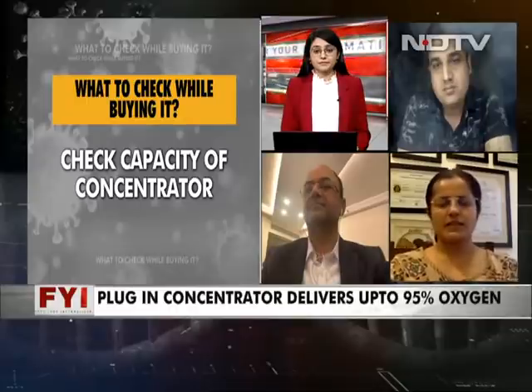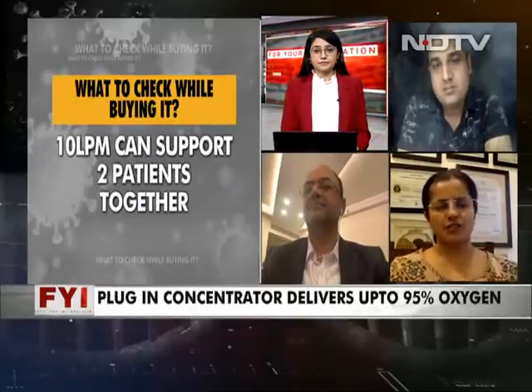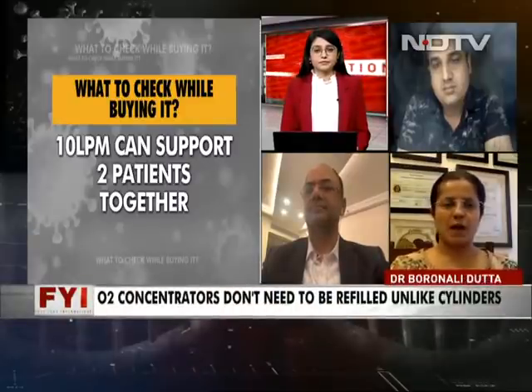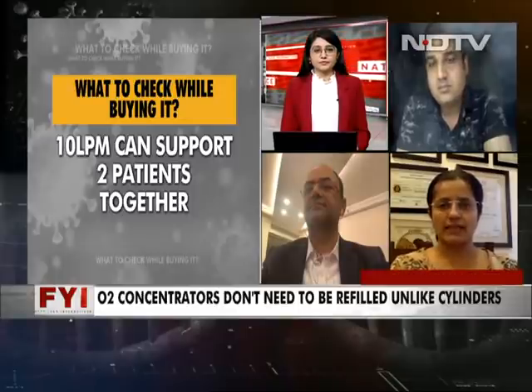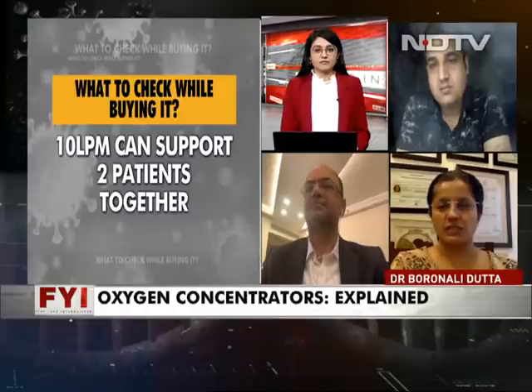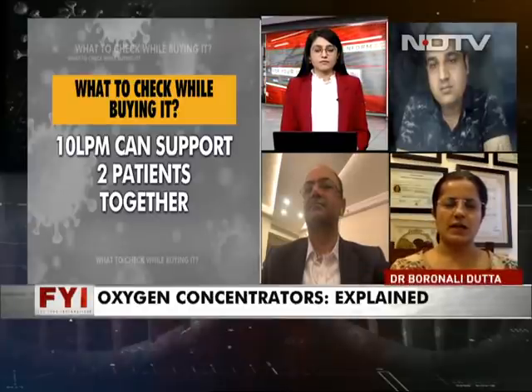Yeah, absolutely. So I think hydration, good ventilation, these are essential things. They all work on power. So again, power failure and things, people worry about that because we do have outages, and then what happens with oxygen supply. So many people keep a backup of cylinder, which is also reasonable.